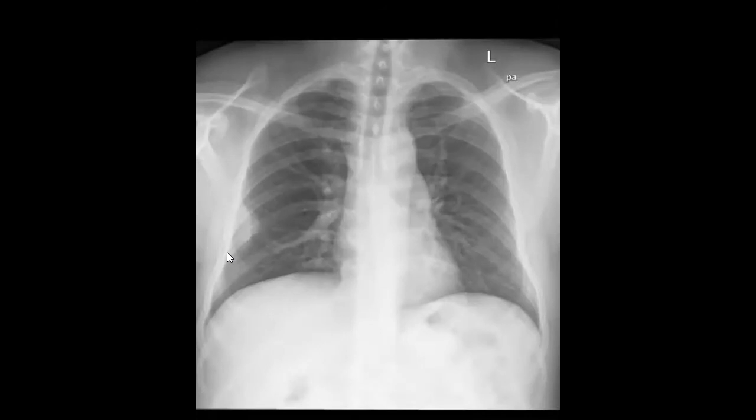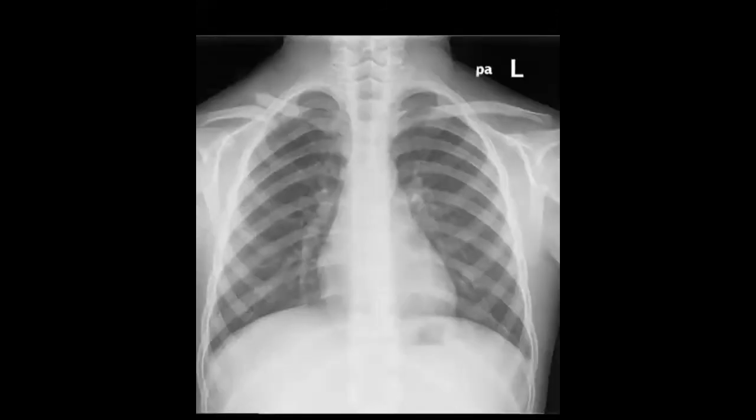So what do you think? Yeah, there is something related to the chest. It can be pleural or a chest wall lesion. One of the good differentials is also a chest wall lesion, like a neurogenic tumor or something. But I agree with you, it can be pleural. This one is easy.